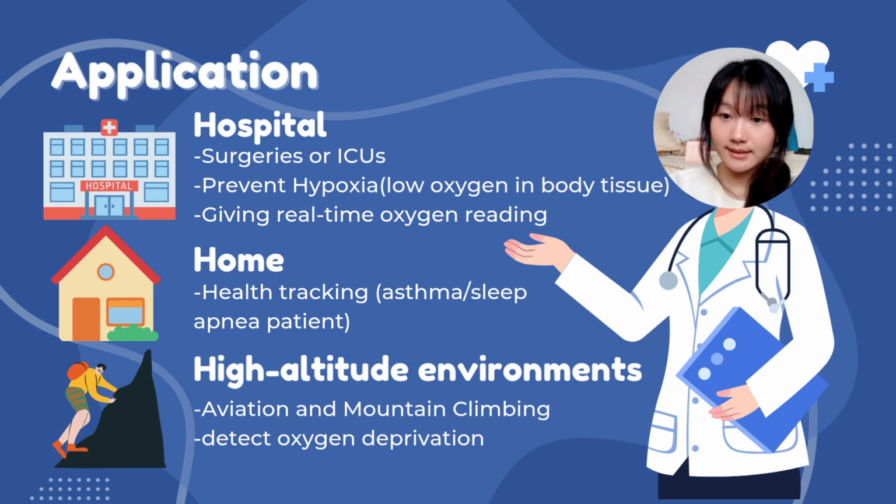In each case, the device's ability to analyze light absorption in the skin reflects the crucial use of the EM principle in a real-world biomedical context.